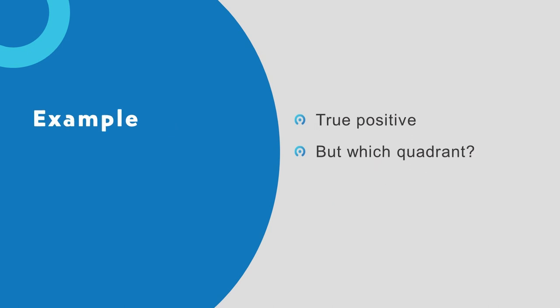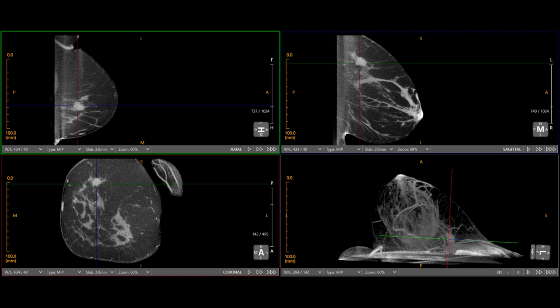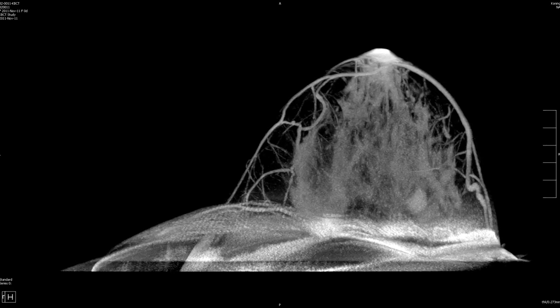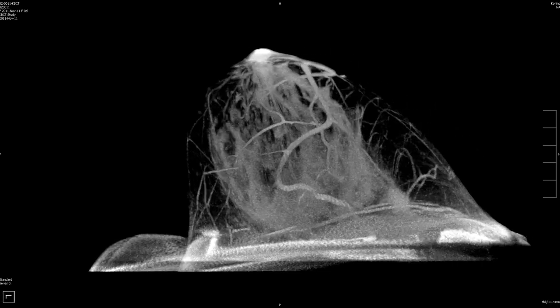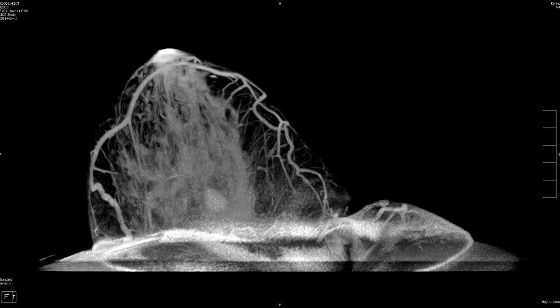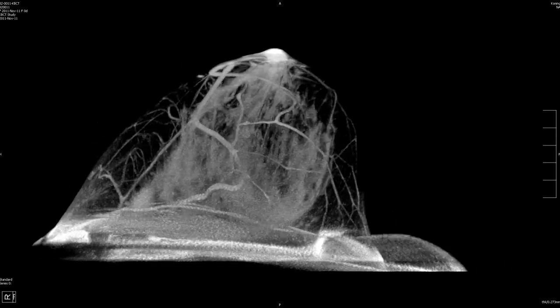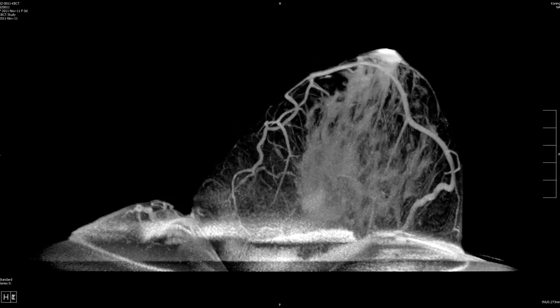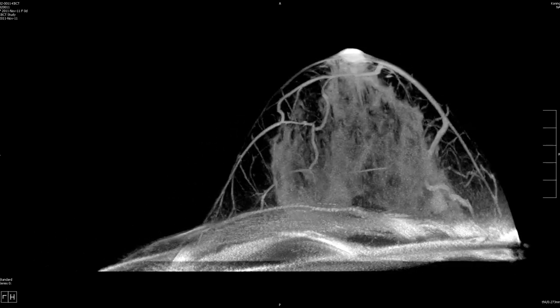Here's one with a mammogram showing something going on in the upper breast — a lot of density and something there. And here's the cone beam without contrast. You can see quite clearly it's in the upper breast — right there on the CC and on the coronal. So this is great: if you have to go in with your ultrasound, you know exactly where to look. And the 3D reconstruct here is enlarged — without contrast, it shows exactly where it is. You can then biopsy or go after it with ultrasound.